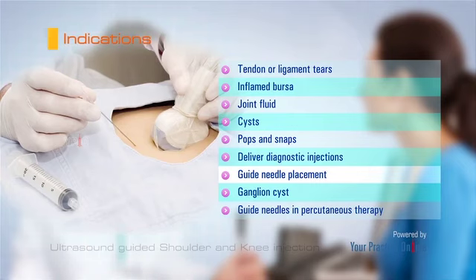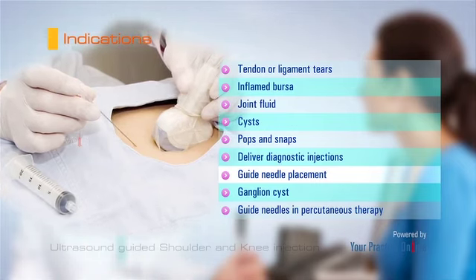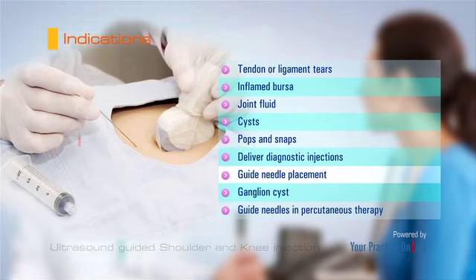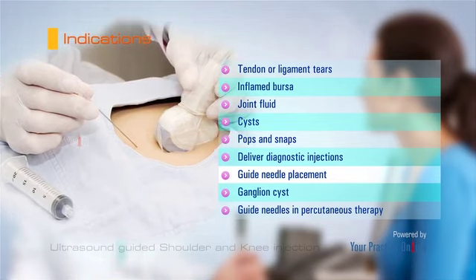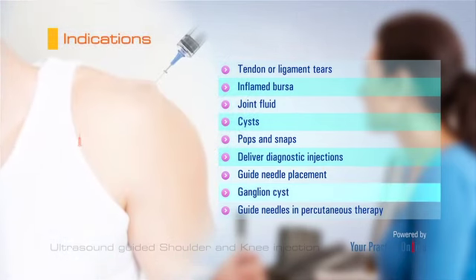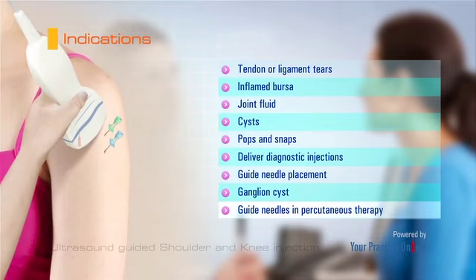Help guide needle placement during needle aspirations or injections for patients with challenging anatomical variations or people taking blood-thinning medications. Aspiration of a ganglion cyst. Guide needles in percutaneous therapy for the treatment of calcific tendinitis.